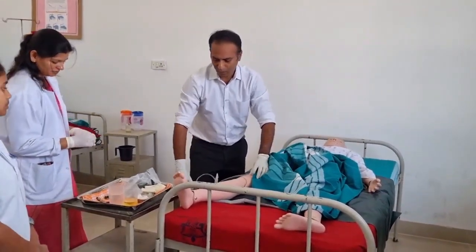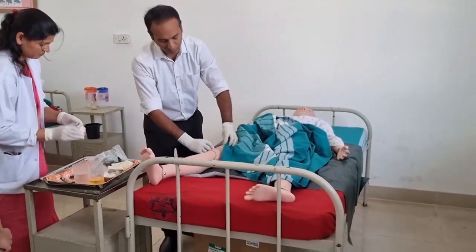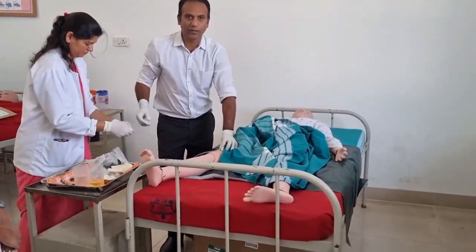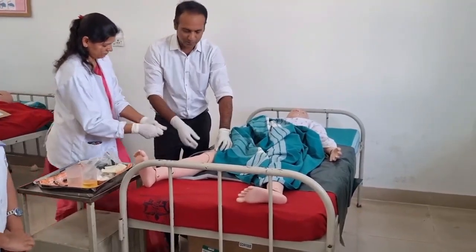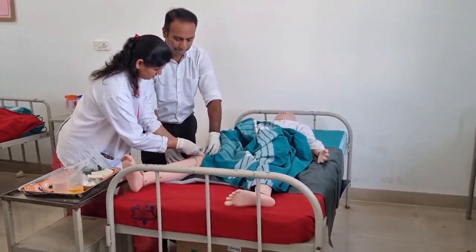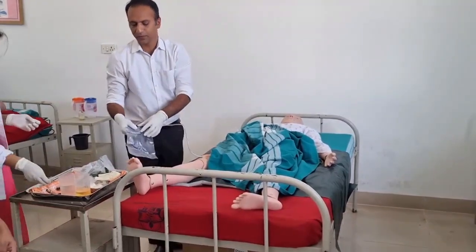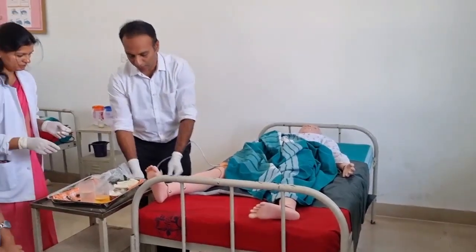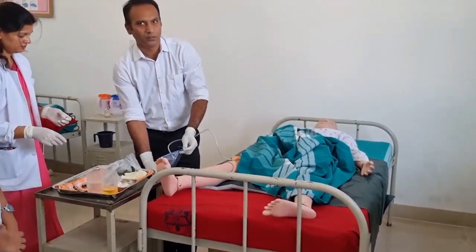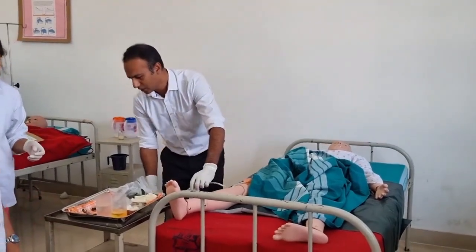Generally, we can secure the urobag to the thigh using adhesive plaster or easy fix. The urobag can be tied to the cot end wherever the provision is available. This is the procedure. And for your knowledge, I'll show you.